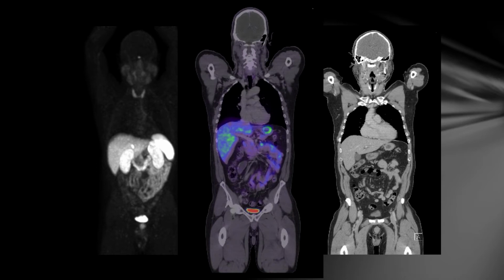So these images, just to clarify, are what we call a coronal image. Here is the head, the chest, and the abdomen, and we've got uptake within the liver. This is the kidney, the other kidney. Here's the bladder, that's the spleen, and up here, this structure is the thyroid gland. So these are all normal sites of uptake.